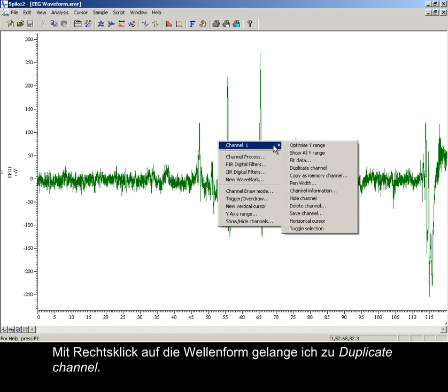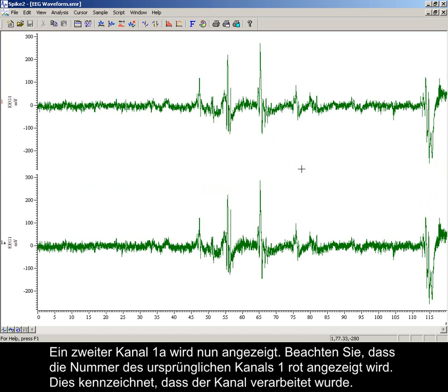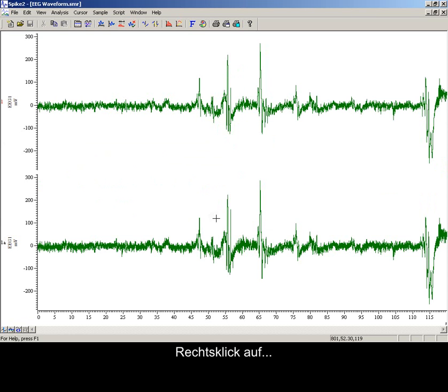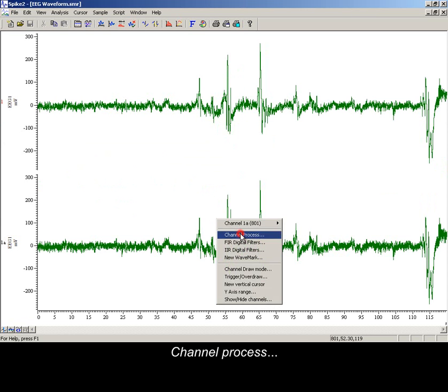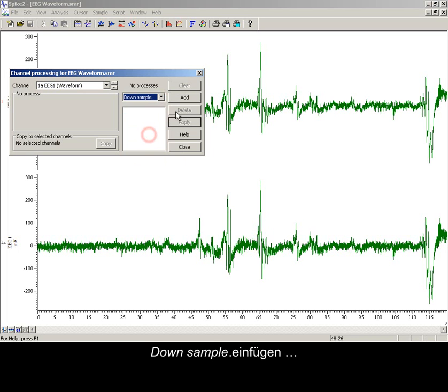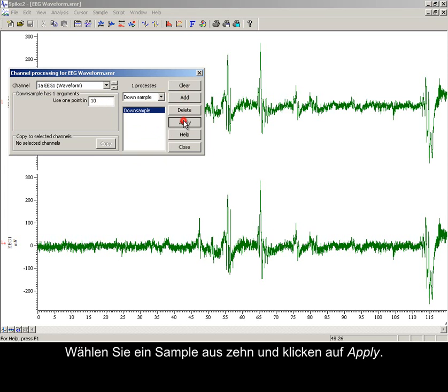Right clicking the waveform to access duplicate channel. A second channel 1A is now displayed. Notice the original channel number 1 is displayed in red, indicating that it has a channel process applied. The duplicate is at the original 1000 Hz rate, so I will down sample this to match the 100 Hz required. Right click, channel process, add down sample, choose one sample in 10 and apply.